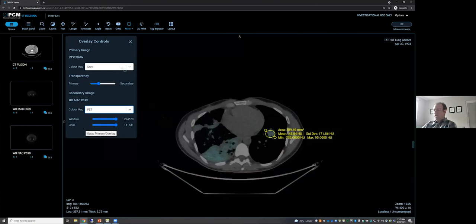That's about it in terms of the viewer — it's a pretty straightforward viewer and we've just been building pieces. The ROI features are pretty standard and we want to make them slightly more impressive going forward.